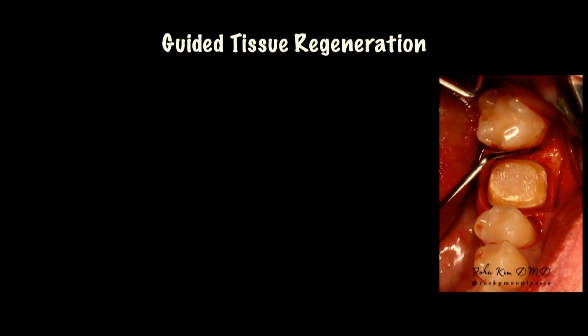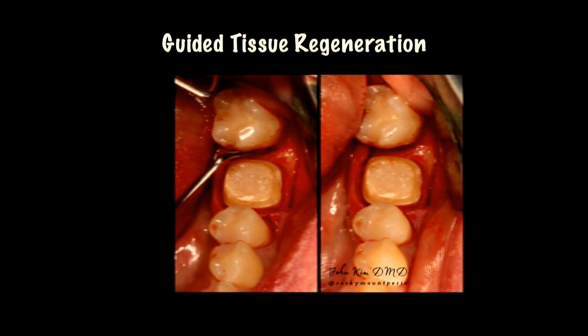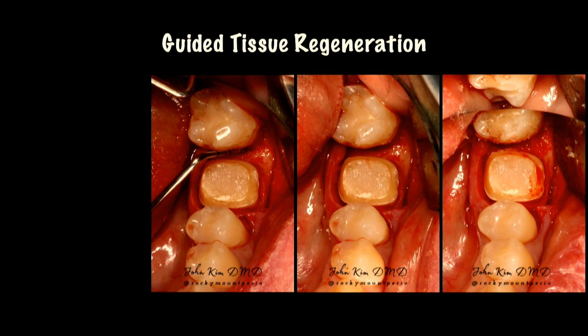And so I want to showcase a case in just conventional periodontal therapy. I don't know about you, but for me, I find GTRs harder to achieve good, predictable results than I do in my GBR procedures. And a lot of time it's because of access. And here we have a narrow infrabony defect. I was very fortunate that I was able to take out the temporary crown to have better access here. Cleaned it out thoroughly as I could.